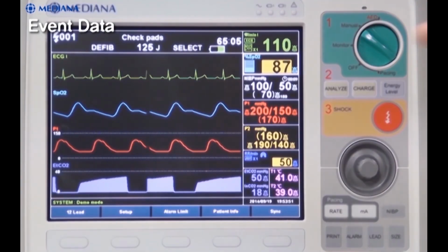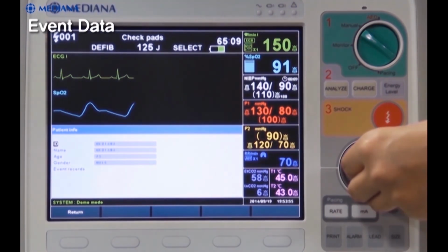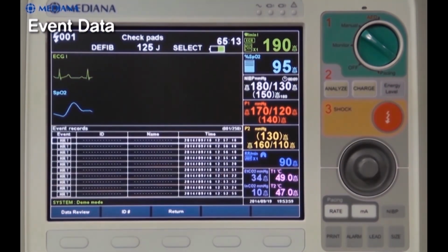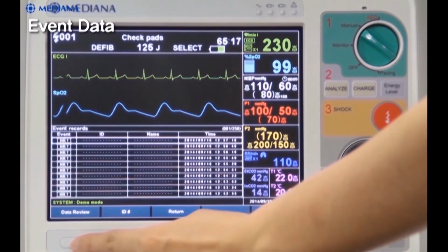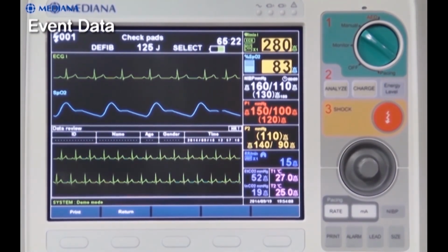Event data. The D500 can save 250 event data in both graphical and tabular format. Let's see how to use the event display. Press the Patient Info soft key and rotate the multifunction knob to Event Records on the screen, and press the multifunction knob to Display. Event information is presented in tabular format for all monitored parameters.